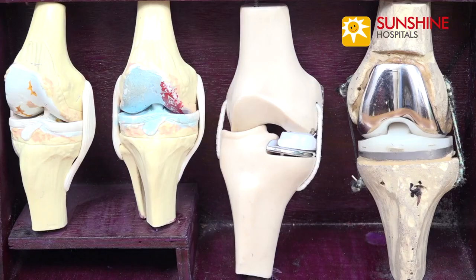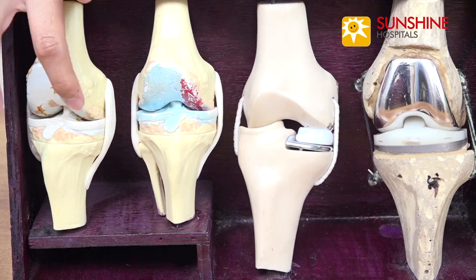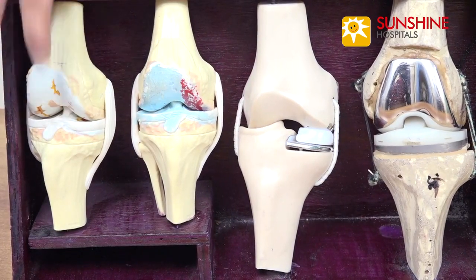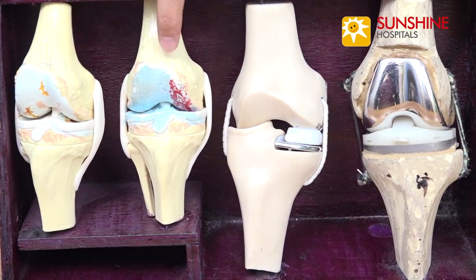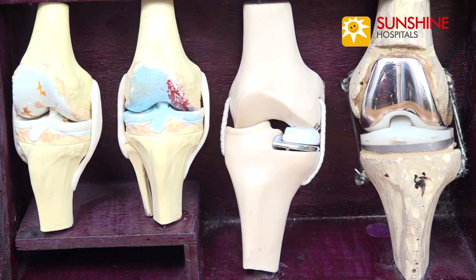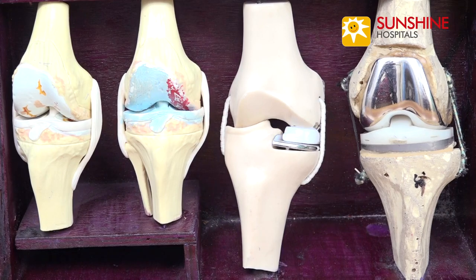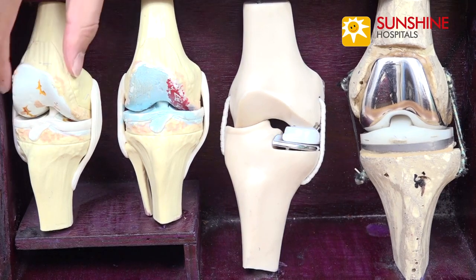I'd like to tell you a little about partial knee replacement, or as we call it, unicondylar knee arthroplasty. If you see this model, this is a knee joint where the cartilage is worn out uniformly around the surface of the femur. But in this particular model, the wear of the cartilage is only restricted to the inner side of the joint — this is known as the medial compartment. Most knee joints start the wear on the medial side, but by the time the patient comes to us, the wear usually has spread across just like this knee.